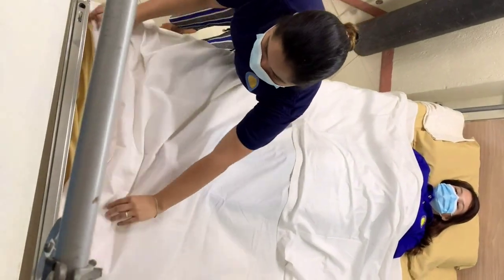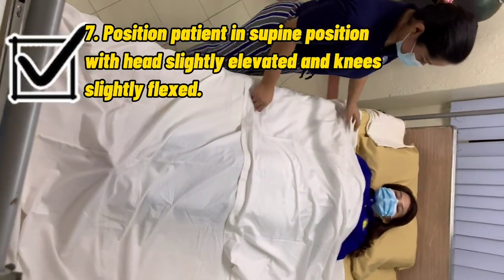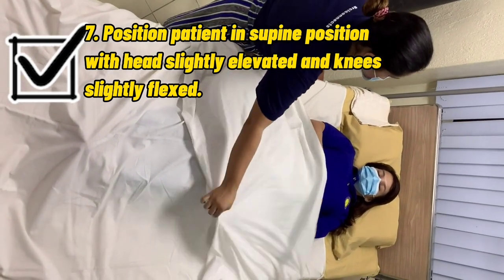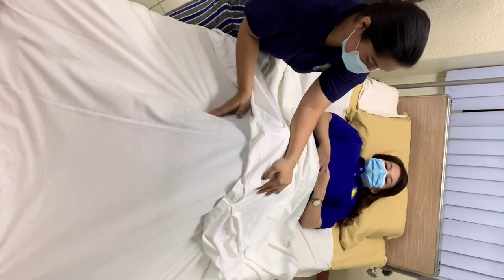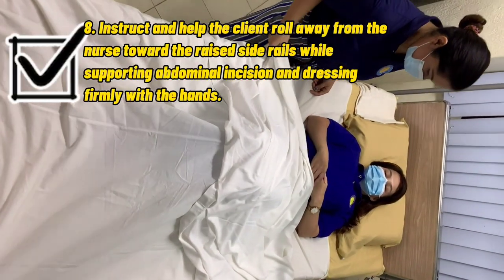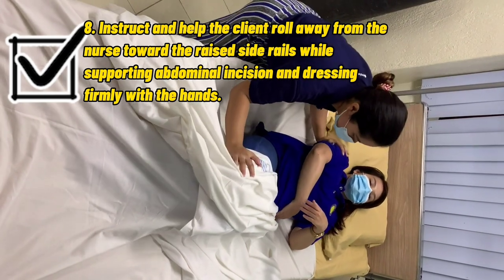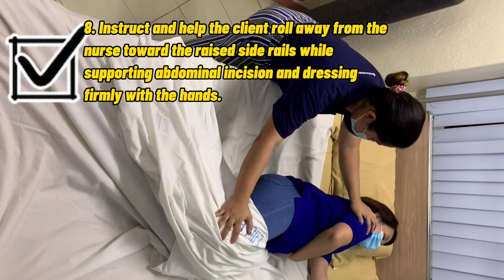Position the patient in the supine position with the head slightly elevated and knees slightly flexed. Instruct and help the client roll away from the nurse toward the side rails, while supporting the abdominal incision and dressing firmly with hands.